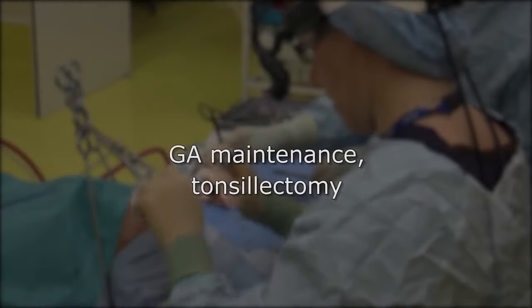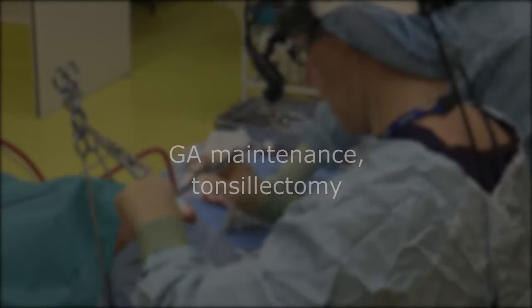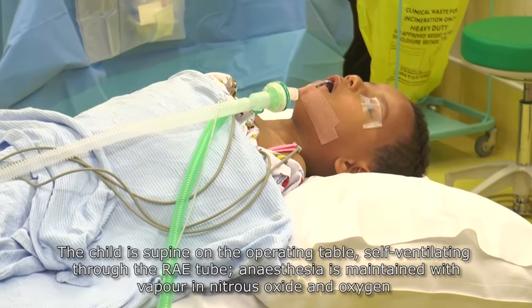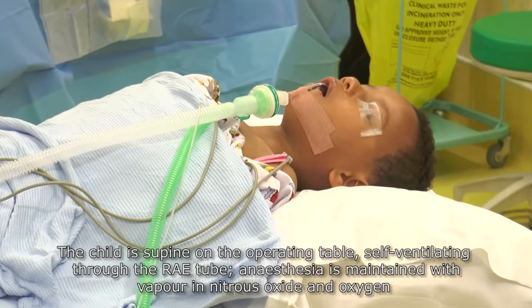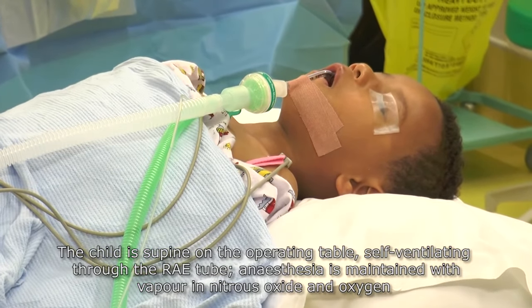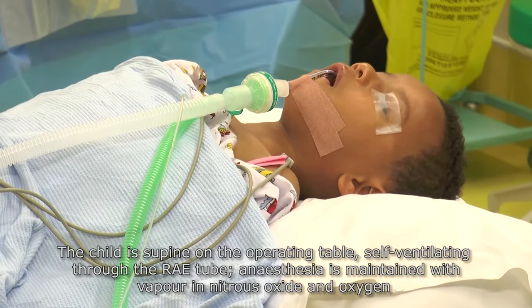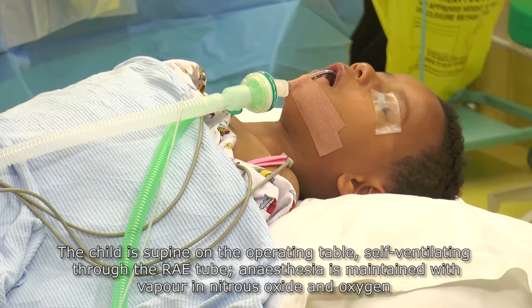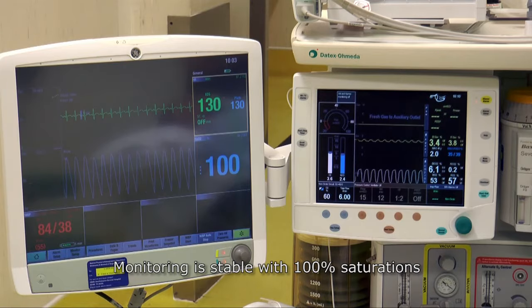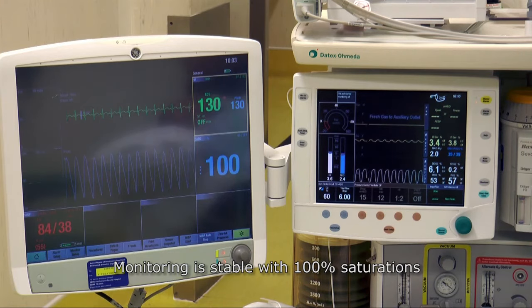GA Maintenance Tonsillectomy. The child is supine on the operating table, self-ventilating through the RAE tube. Anaesthesia is maintained with vapour in nitrous oxide and oxygen. Monitoring is stable with 100% saturations.